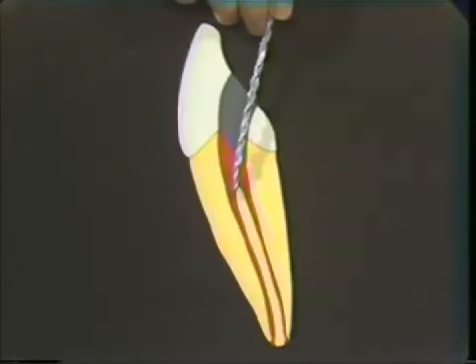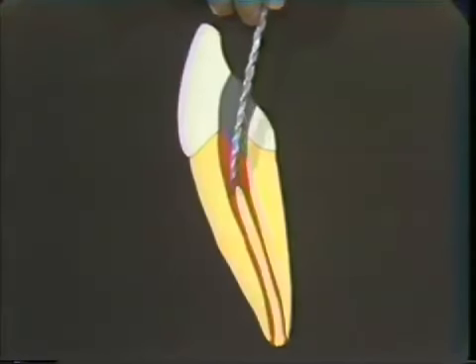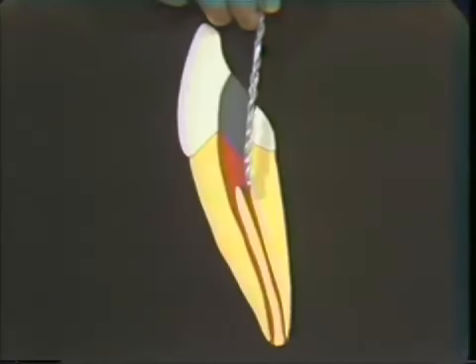If you have a second canal, when you lift the file up, or the explorer, and then go in the other direction, you'll be able to feel a little click and the file will be going in a different direction as you slide over into the second canal. So always check mandibular anterior and bicuspid teeth for 2 canals.